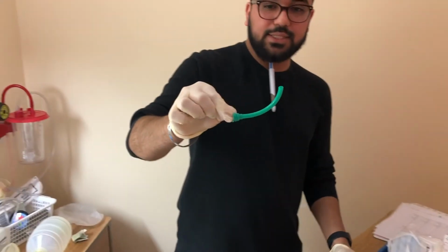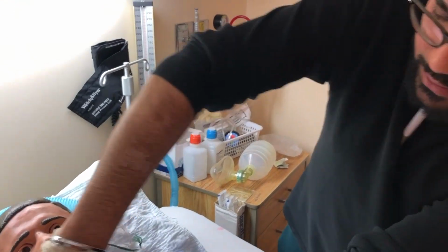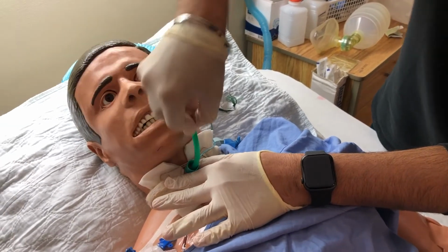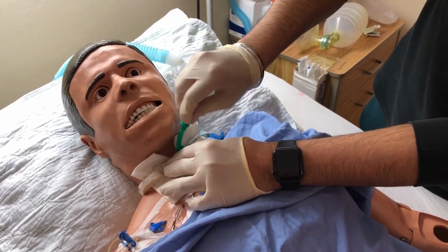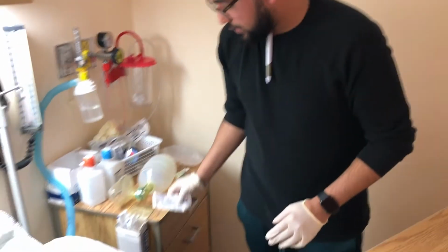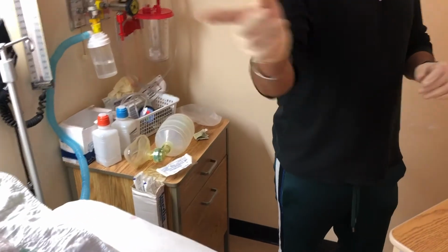I would grab this one as such, making sure to maintain sterility, stabilize this, and put it in as such there. So that's the inner cannula that's changed. We're good to go.